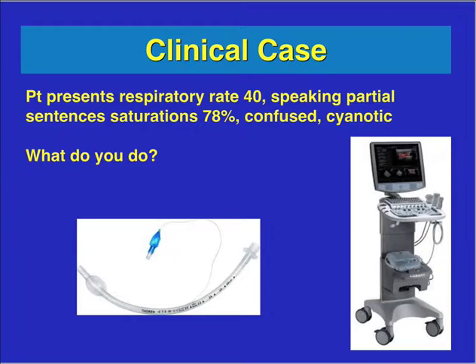When I have just recently placed someone on non-invasive ventilation and I'm trying to figure out which is the predominant cause. A lot of times these patients have almost every condition you can think of. You know, they're not taking their Coumadin, they have COPD, they have heart failure, and they're coming in with respiratory failure, and you're trying to identify which component is affecting the patient the most. And this is where I use ultrasound to help me out.